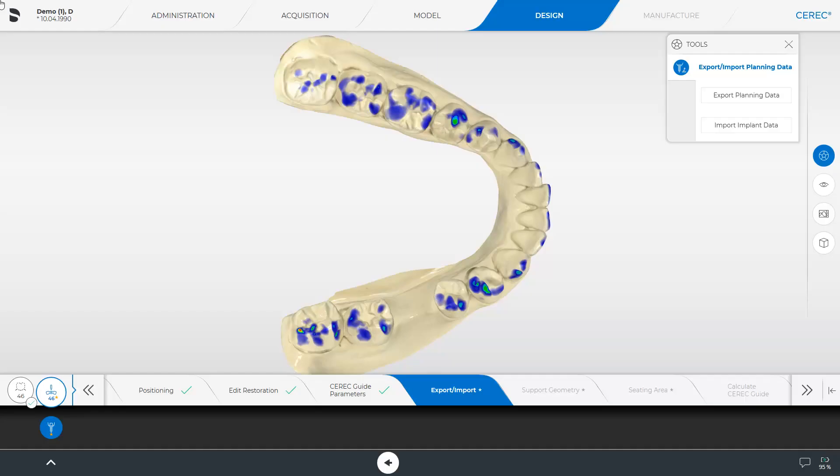In part 1 of this tutorial series, we set up the case and exported the prosthetic planning in the design step. In parts 2 to 4, you learned how to perform implant planning in CEREC Implant. We have accessed our implant case again and are revisiting the design phase.